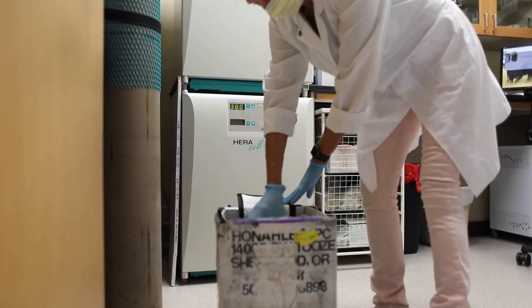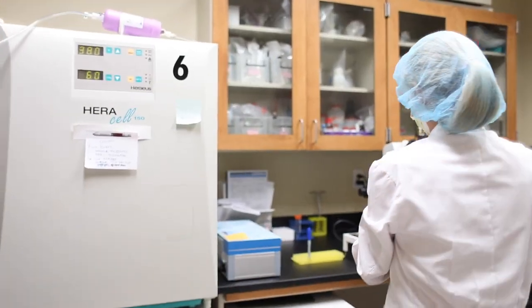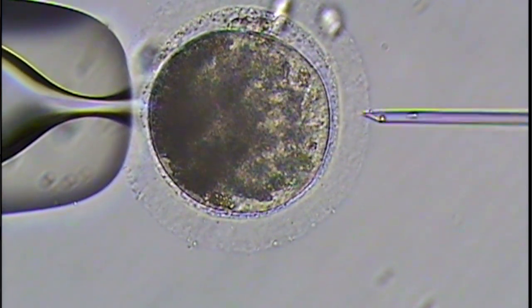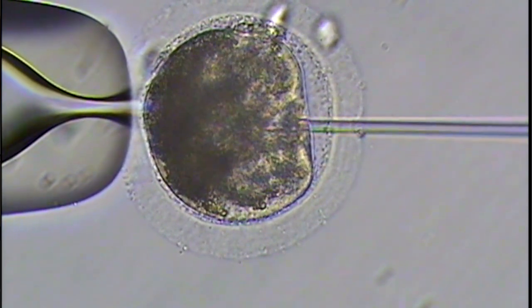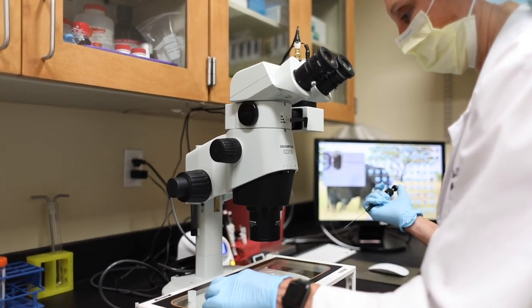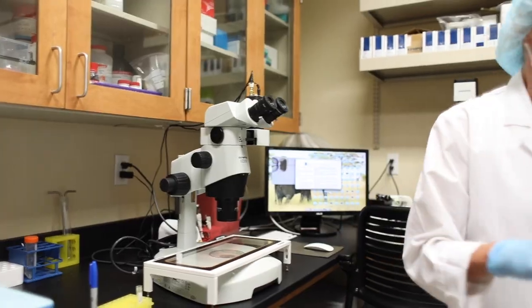At our Equine IVF lab we receive oocytes from veterinarians from all over the United States. We take those oocytes, which are either matured in the mare or immature oocytes, and we inject them with a single sperm. Those developing embryos are in our incubator for seven to ten days, then we ship them back fresh and they are transferred into a surrogate mare.